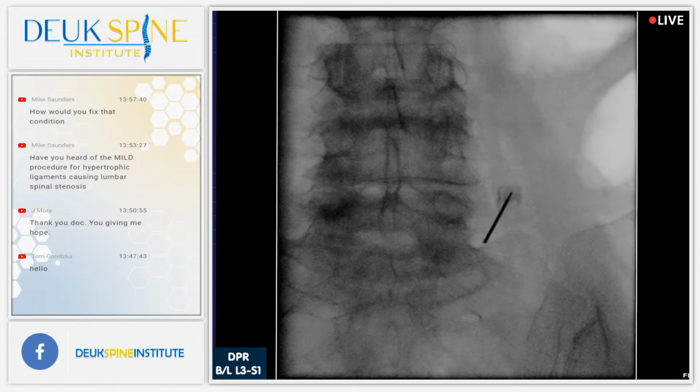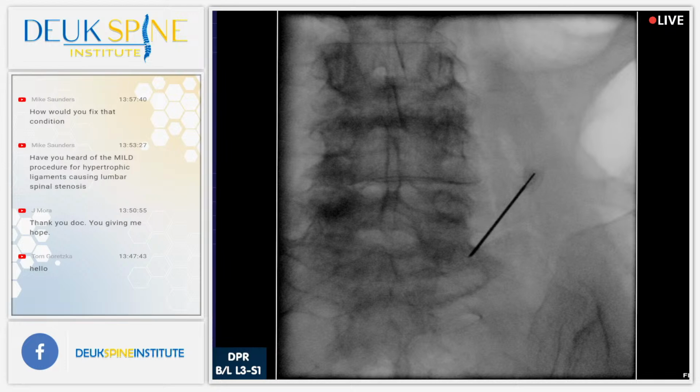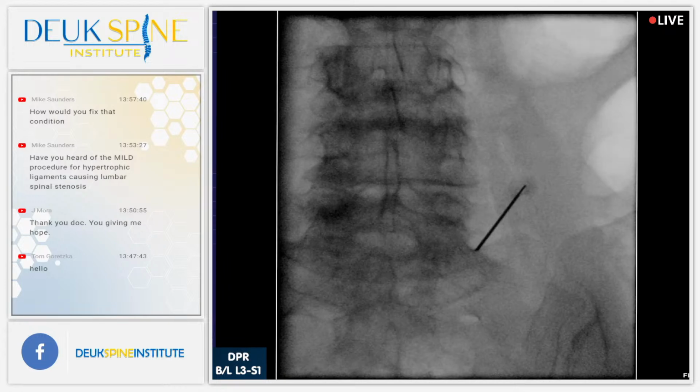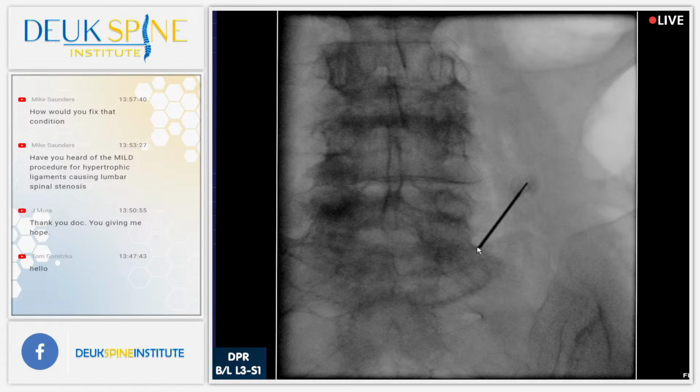Well, can you show us our target there? It literally comes from arthritis in the facet joint, or the pain in the facet joint comes from arthritis. Shot. A lot of scar tissue here, but that's the target right there. You guys see that? Right where the tip is. That little cleft. Yeah. All right, this will be our last one.